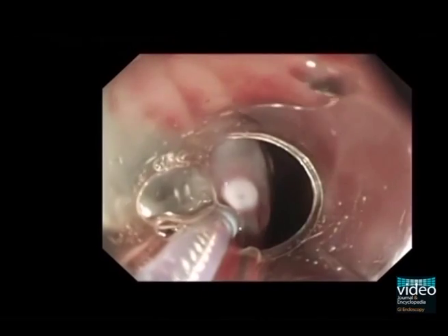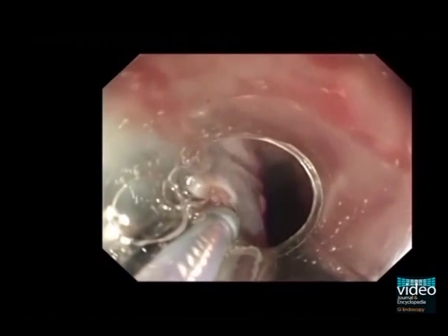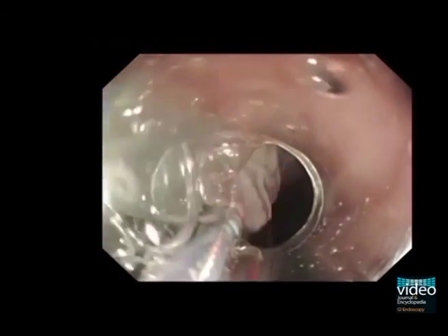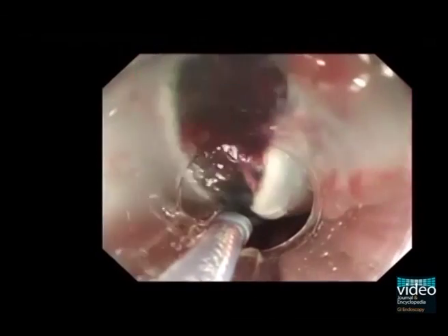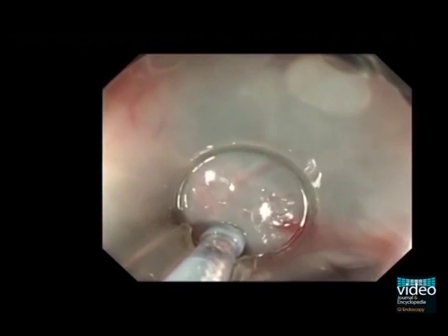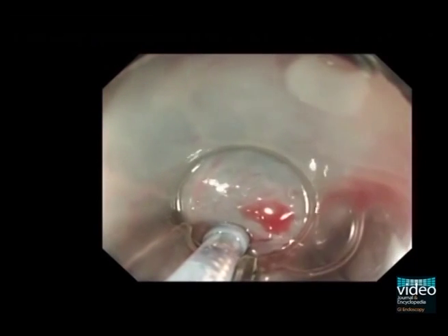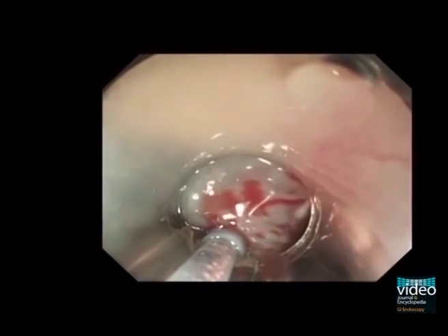Mucosal incision was performed with the flex knife, which was set to about 2 mm in length. The electrosurgical generator output was set at duration 2 and interval 3 of endocut 1, effect 1. Firstly, lateral margins outside the tumour were incised. Secondly, the distal end and finally the proximal end were incised.